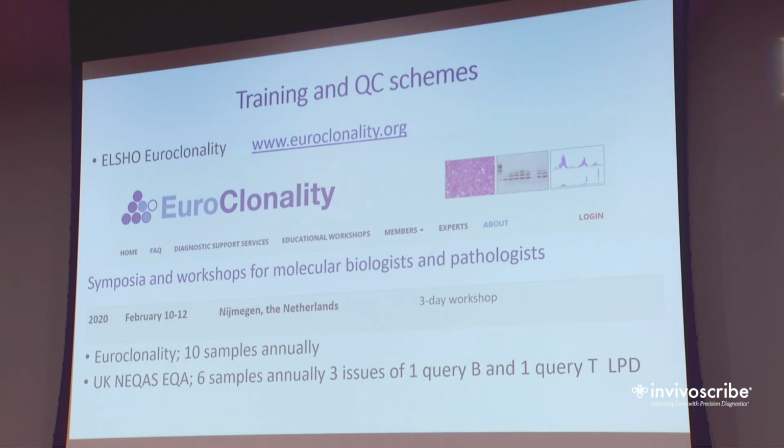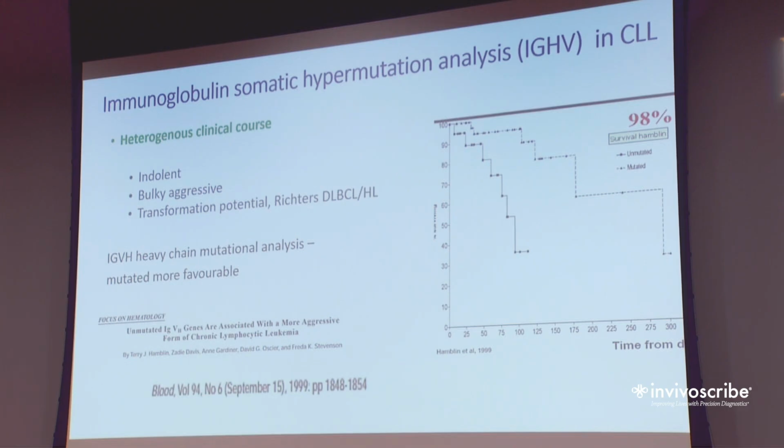So that's the way they're doing it at the moment. Obviously, when NGS takes off, they're going to have to think about sending you FASTQ files and things to look at, because, as I said, that is happening at the moment. But the only EQA schemes out there at the moment don't use the NGS data.